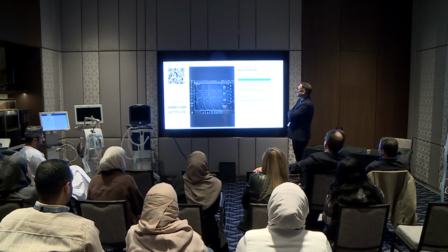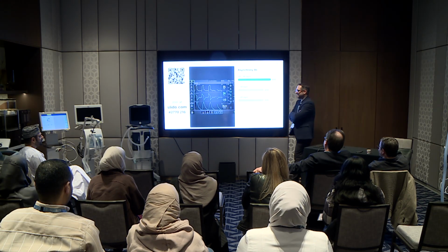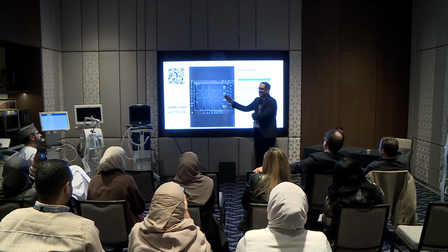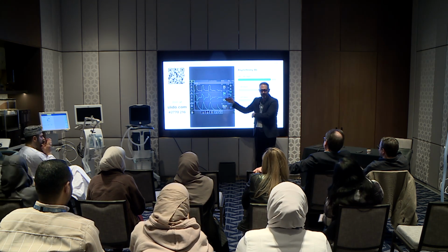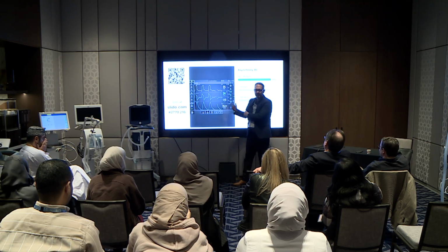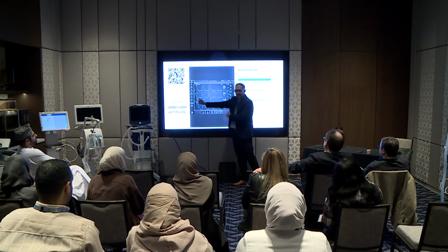We got some changing there. I couldn't figure out how to make it so you couldn't change your answer, but I see what's happening here. Okay, 24 breaths per minute is what the ventilator is measuring, because that's how many times it's triggering the ventilator in a minute. After every breath is a missed trigger.